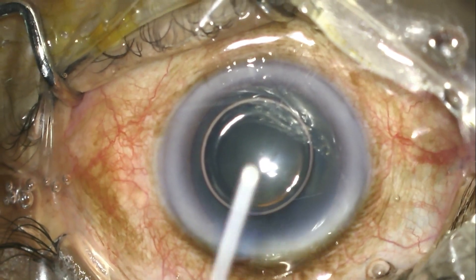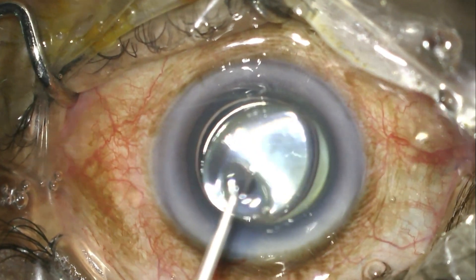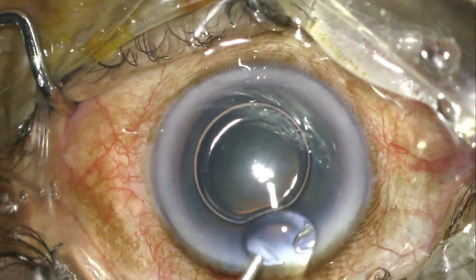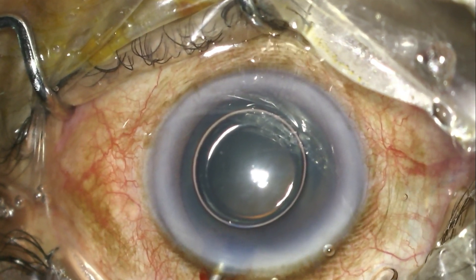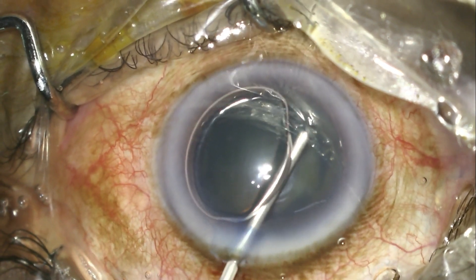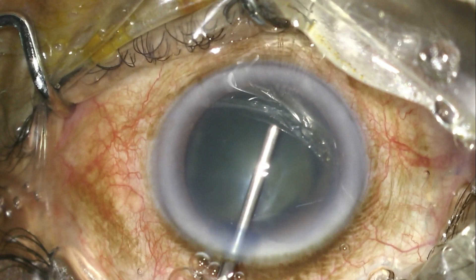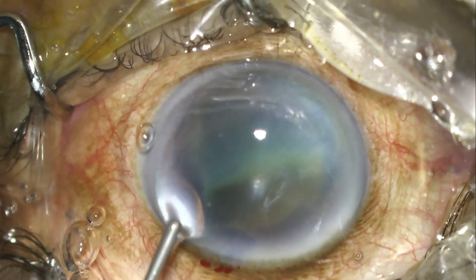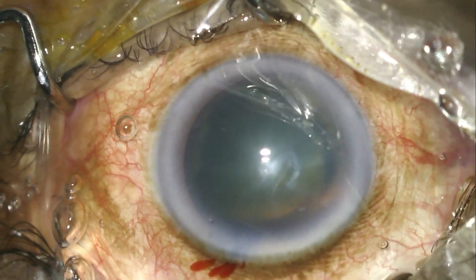The surgeon then takes some viscoelastic, removes a little outside the eye to ensure there are no air bubbles in the cannula, and then injects viscoelastic into the anterior chamber beyond the bubble, gradually moving backwards. This results in a uniform staining of the anterior capsule.